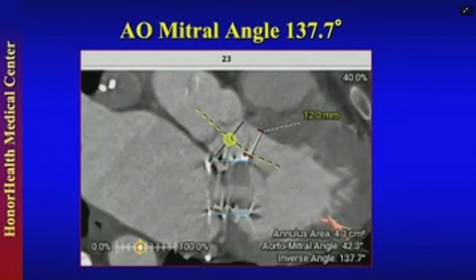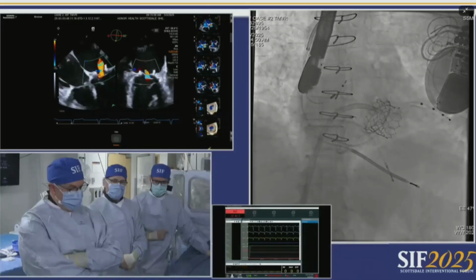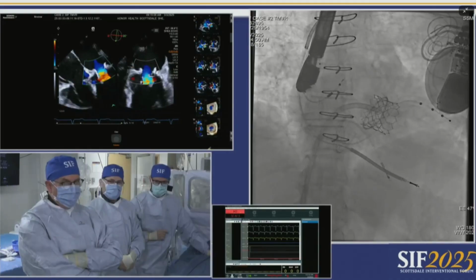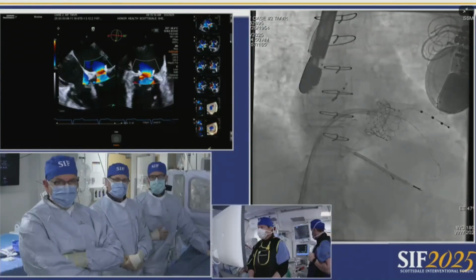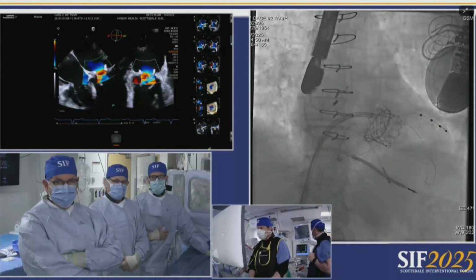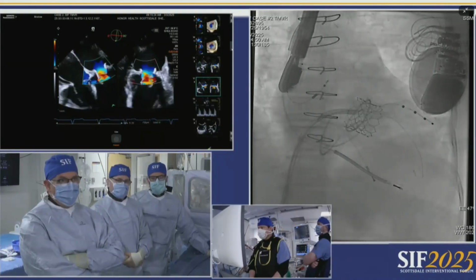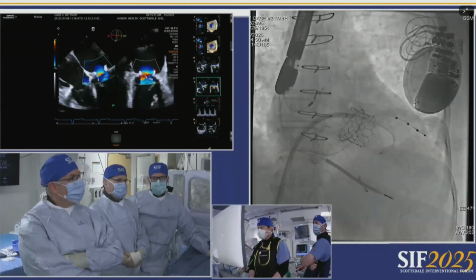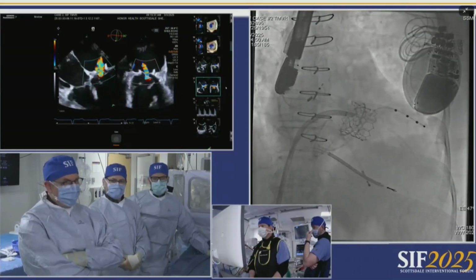Oh, Dr. Riley, I'm going to ask a comment real briefly on this IMR ring and pros and cons and why it was used. Yeah, so originally this was done in 2017. This was a pre-COAPT patient, so it was an EF of about 25% at the time with dilated mitral and tricuspid annulus. So it was a downsized ring annuloplasty. The IMR is a rigid ring for ischemic functional MR. It's very D-shaped and has a dip in the P2, P3 area to help bring that up for the functional MR patients.